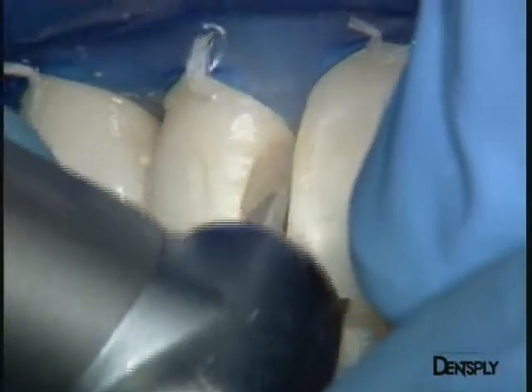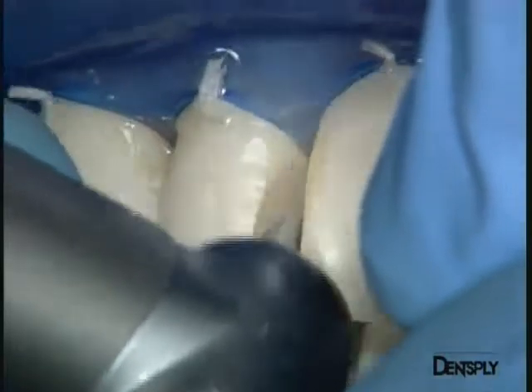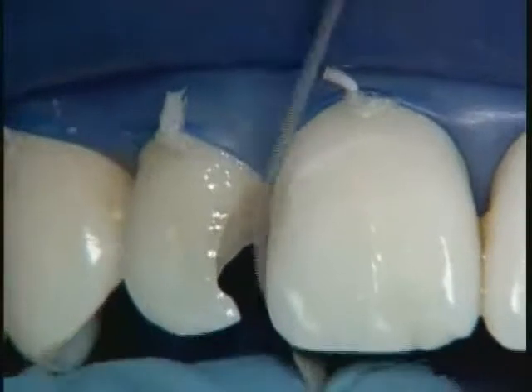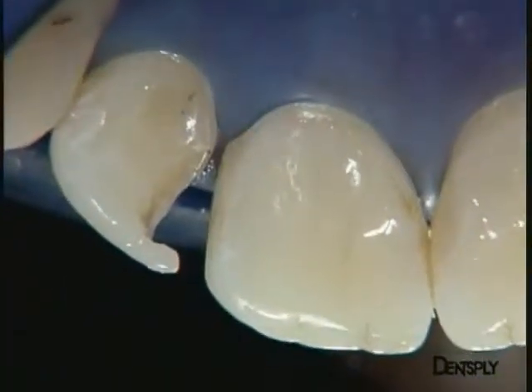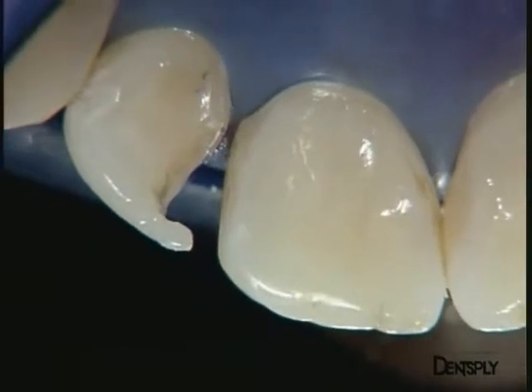To get rid of excess in the cervical region, a diamond burr and a metal abrasive strip are used. A small scraper can also be used to clear excess from the cervical region. As you can see, it's impossible to see the restoration on this central incisor.